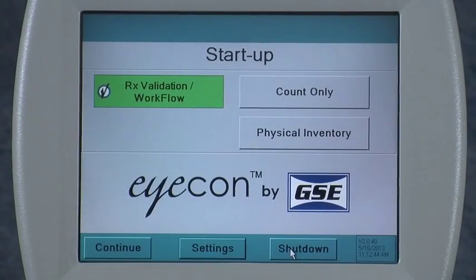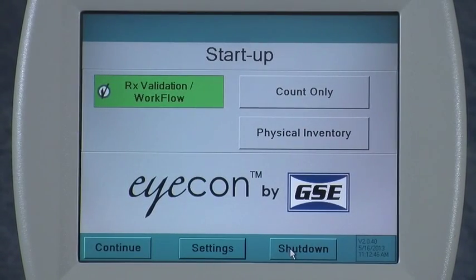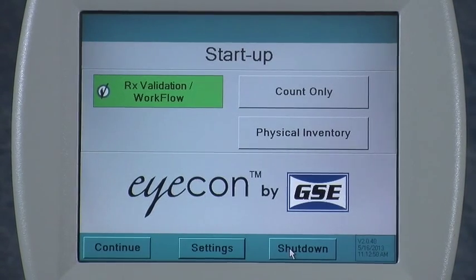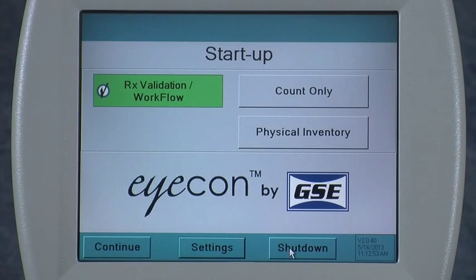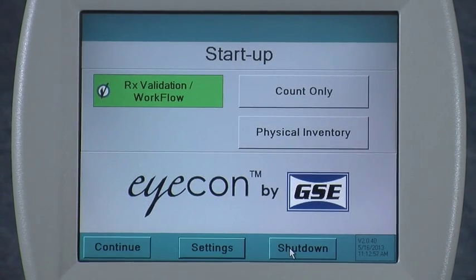Now let's take a look at how you can connect your Eyecon up to the computer network in your pharmacy. You can do this either just to gain access to the files on board the Eyecon, or to actually interface it with your pharmacy management system.